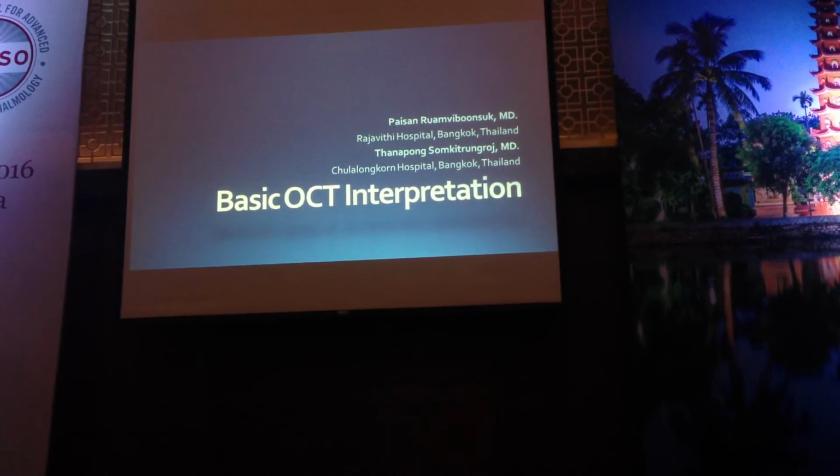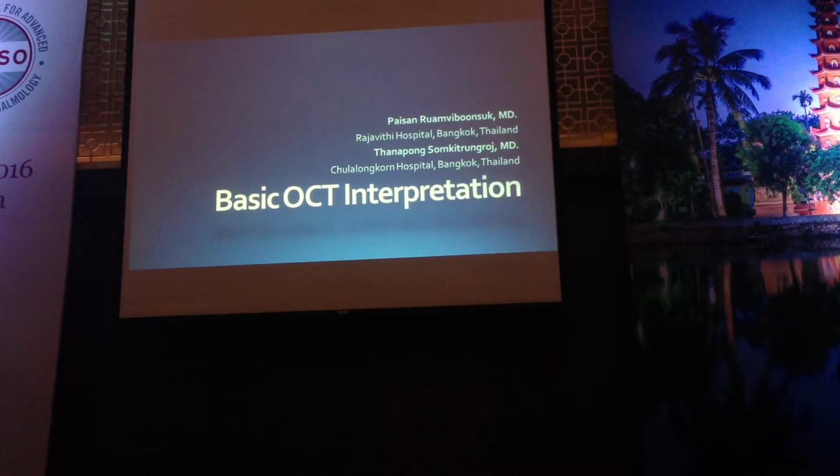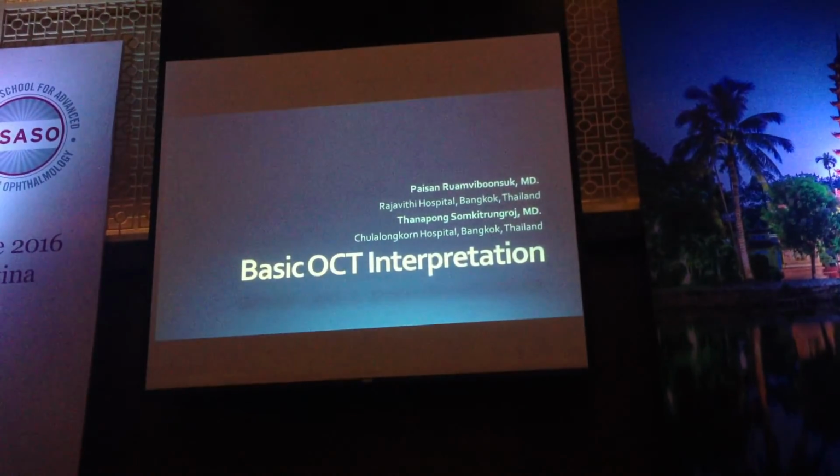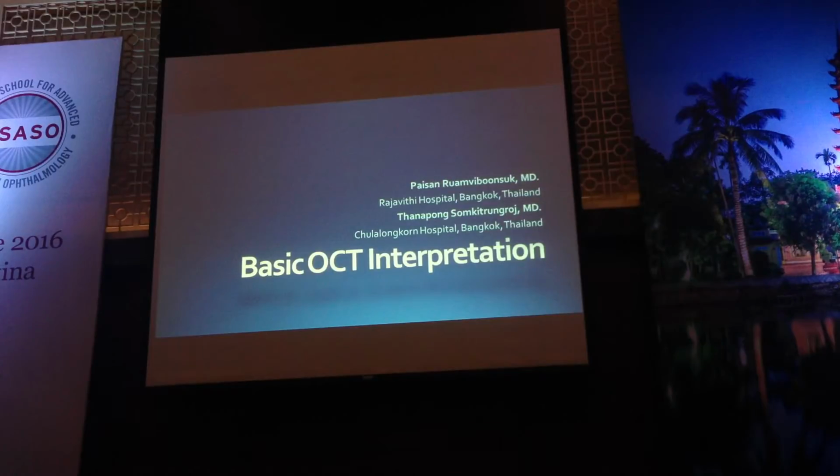Actually, I give my talks in many meetings, and it takes only 10 minutes or 8 minutes, and I have quite a luxurious time here today, like 2 hours, because I'm going to talk about basic OCT interpretation for about an hour, and then after that I talk about the differential diagnosis for diabetic macular edema as well. So it's going to be 2 hours with you this morning. It's my pleasure and honor.